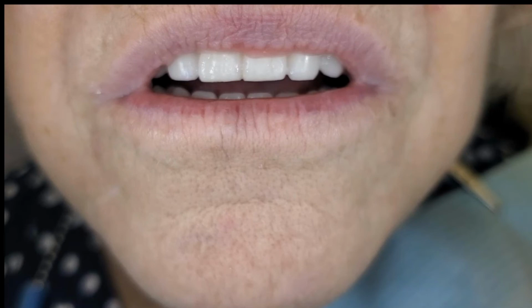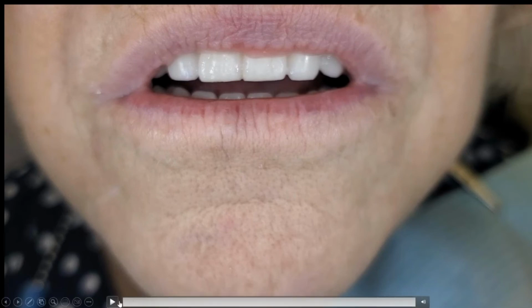So this is VITA Excel anterior teeth and linguiform posterior teeth, all with freedom in centric, and the cusps are all free and clear to work within this system. Now, I'm going to play the video again, and I'm going to tell you something extremely profound about her.